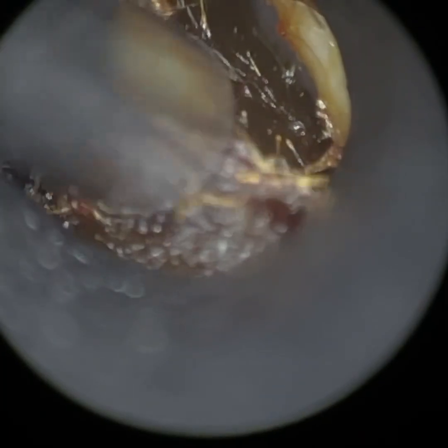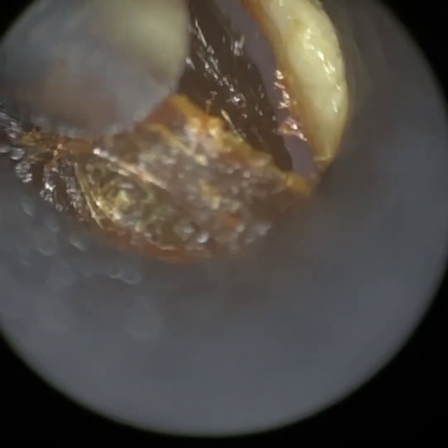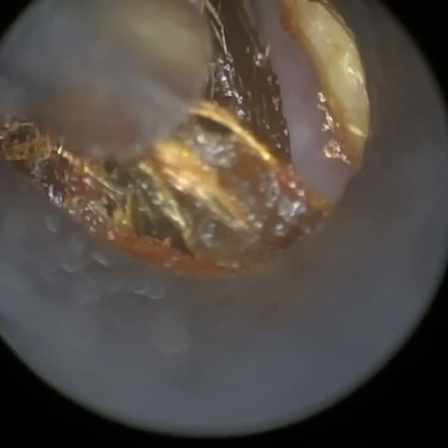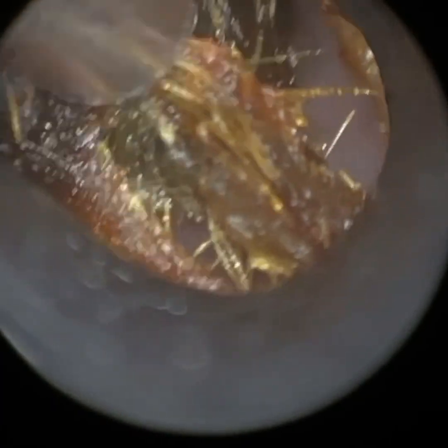In this particular case, we're using it to remove some dark matted earwax from a gentleman who has got narrow ears. I am using our smallest of four speculum sizes, which is the 3.5mm.